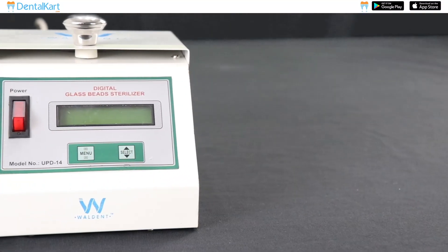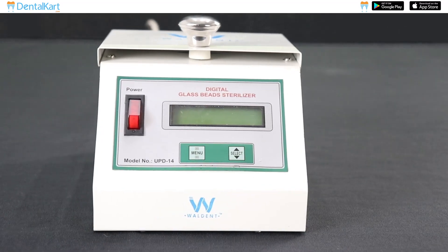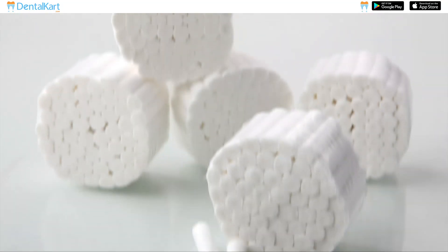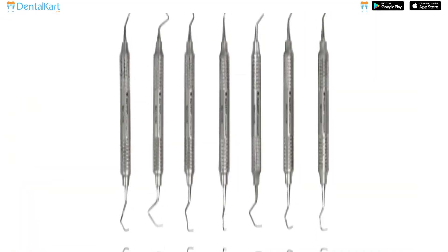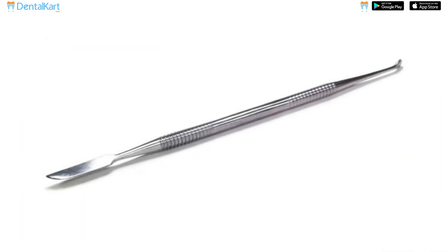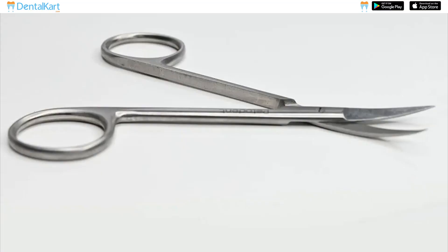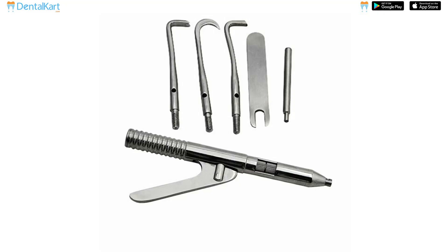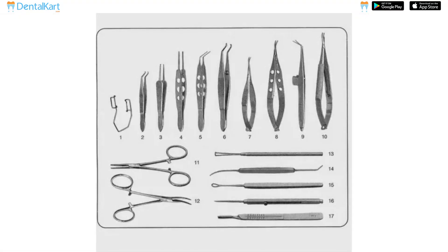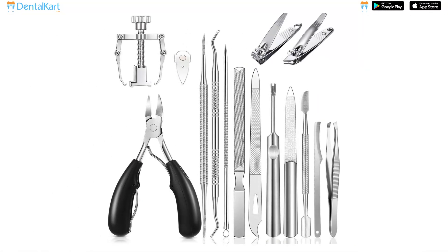Walden Digital Glass Bead Sterilizer is used for sterilizing instruments such as files, reamers, burrs, cotton rolls, paper points, curettes, probes, explorers, mouth mirrors, carvers, tweezers, scissors, and tips of surgical instruments. It is also used in sterilizing ophthalmic, ENT, and minor surgical instruments, and can be used in salons for sterilizing instruments.